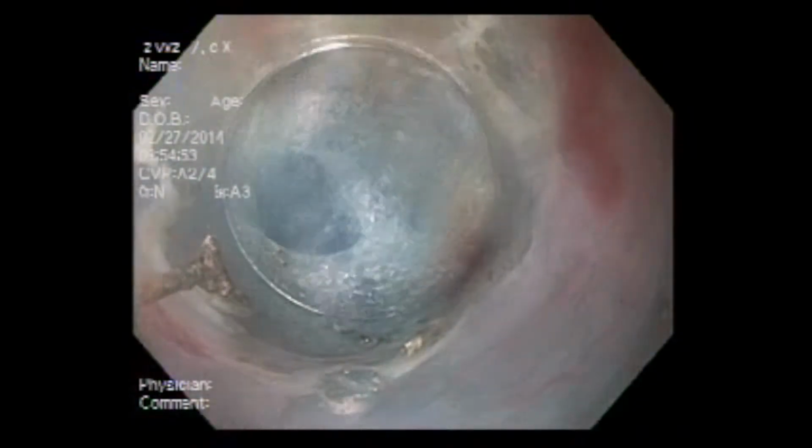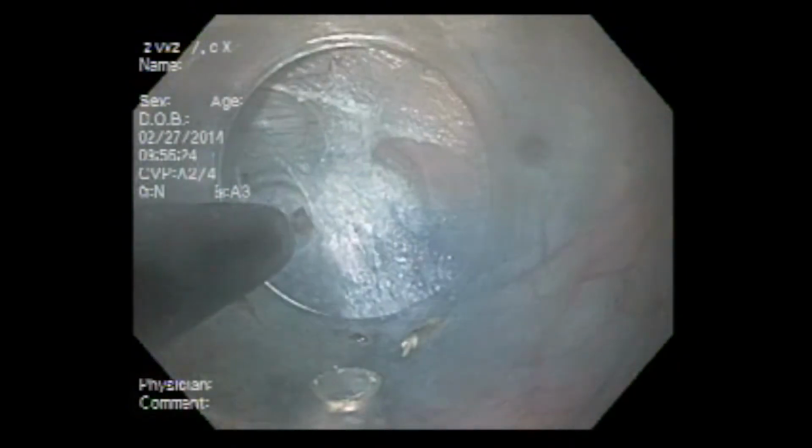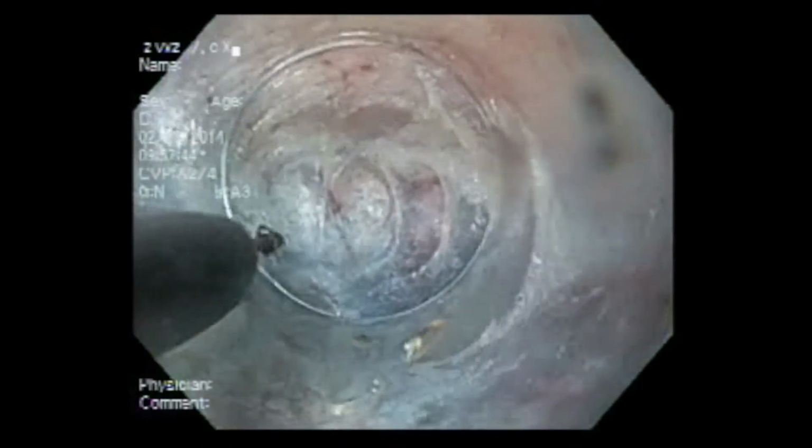The dissection is taken distally until the muscular fibers begin to decussate and disorganize. Adequate distance is also approximated by gross measurement of the distance in which the endoscope is advanced into the newly created submucosal tunnel.